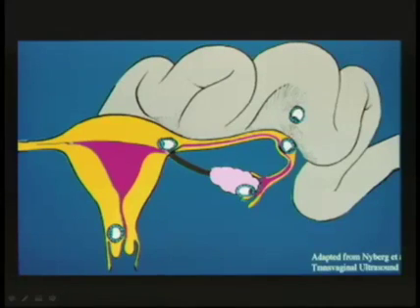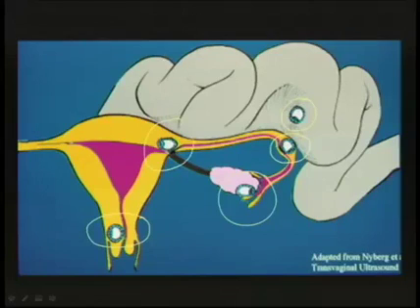Here is a drawing of ectopic pregnancy. As is said, almost all of them are tubal pregnancies, that is, the pregnancy is lodged in the tube as it is here, but they can also occur in the cervix, demonstrated there, or in the ovary, demonstrated here. Even more rarely, the ectopic pregnancy can be outside the GU tract and be an abdominal pregnancy. There's an important subset of tubal pregnancies called cornual or interstitial ectopics, and that's when the ectopic pregnancy is lodged at the cornua of the uterus.